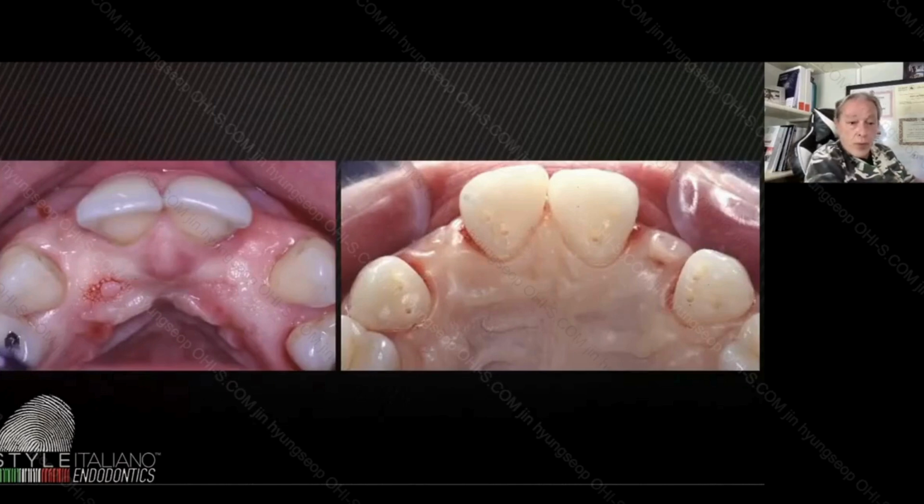Anyway, this was what we had about 35 years ago. Now I'm showing you some restoration performed 35 years ago with no adhesion technique reliable especially for the deep tissues of the teeth. We had something that worked quite well on enamel, but nothing that could withstand the forces of mastication for the dentin. So these were works made with pinledge.